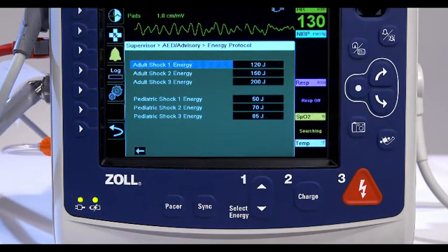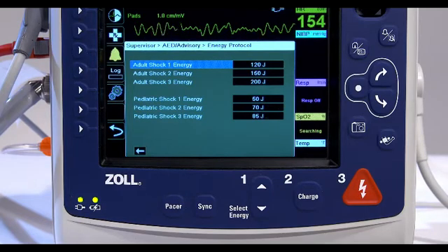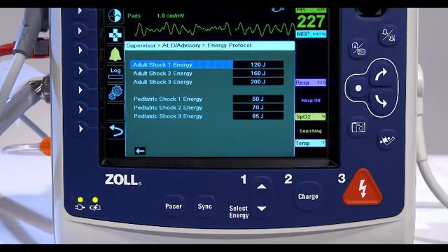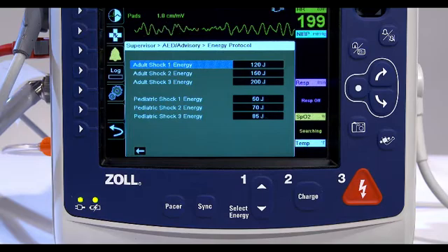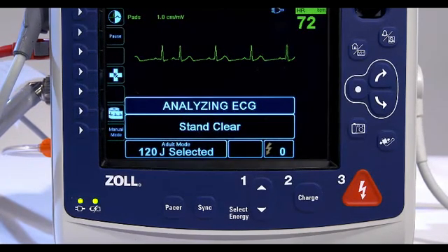Pediatric defibrillator energy levels should be selected based on site-specific protocols. Energy levels can be configured on the ProPakMD to meet local standards. Adjustments can be made in the Supervisor Control Panel, which is password protected.